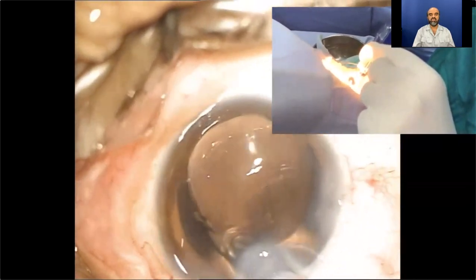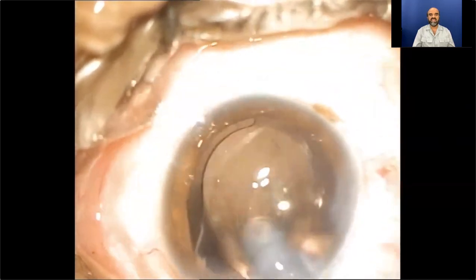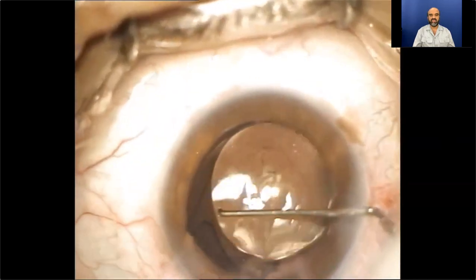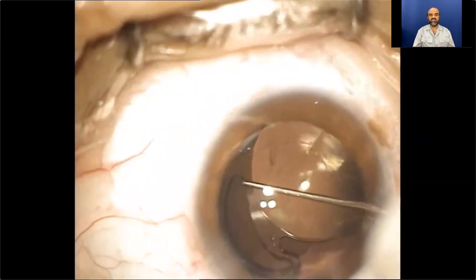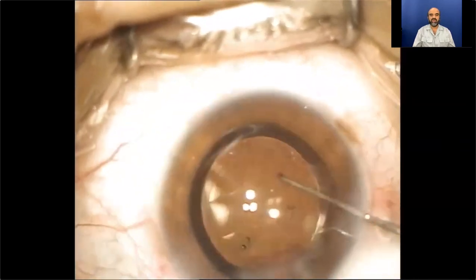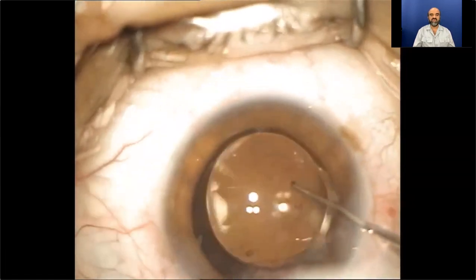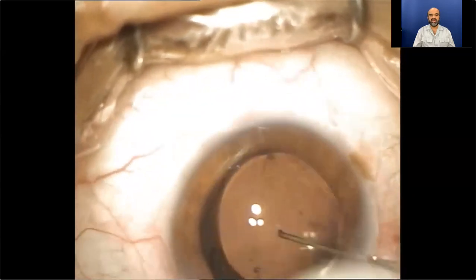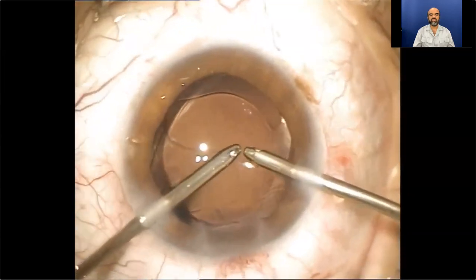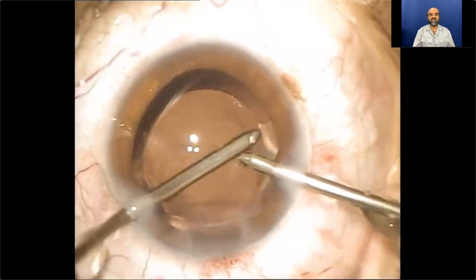You need to be careful while injecting so that you don't entangle the margin of the anterior capsule into the leading haptic. My priority is generally to implant the trailing haptic into the bag with the help of the injector, but in this case it was delivered anterior to the capsule. Thus I used a Sinskey hook to position the lens in the three and nine o'clock positions, and again bi-manual irrigation aspiration comes into the picture.